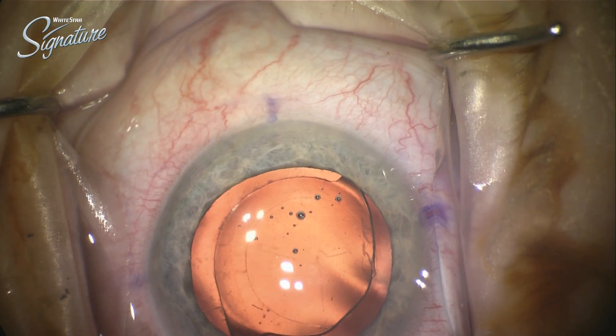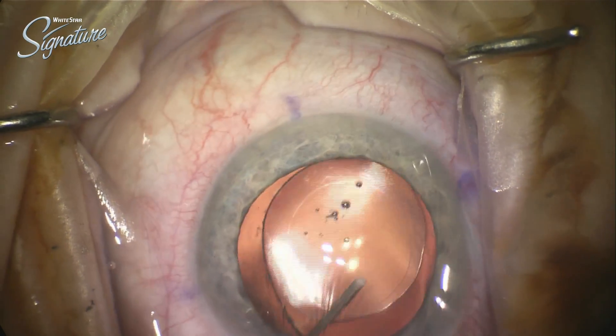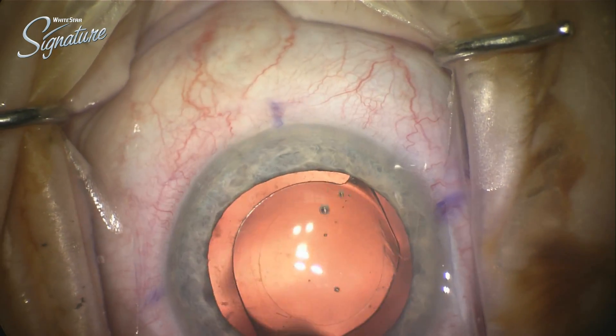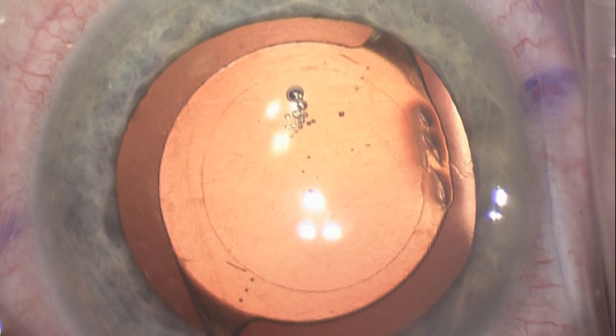I'm really very meticulous with these. I do an awful lot of irrigation back and forth; I want to make sure I've got that lens free within the capsule, but I really don't want to clean the capsule too significantly at all. Really what I want to do is basically place the lens exactly where it's supposed to go, leave it, and then let the normal healing forces take place.